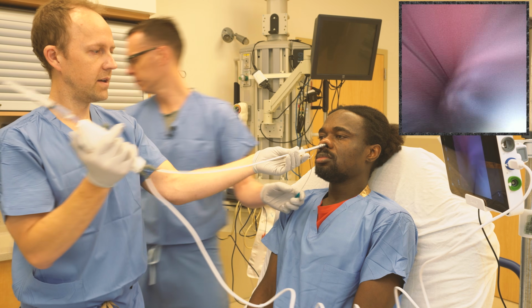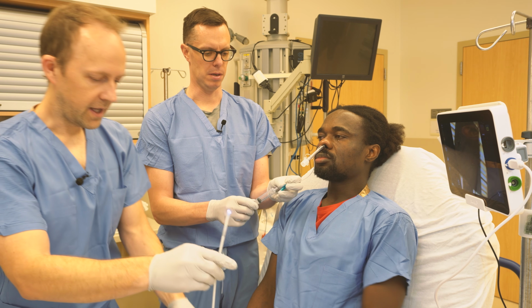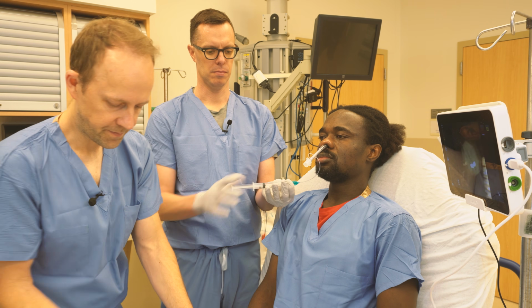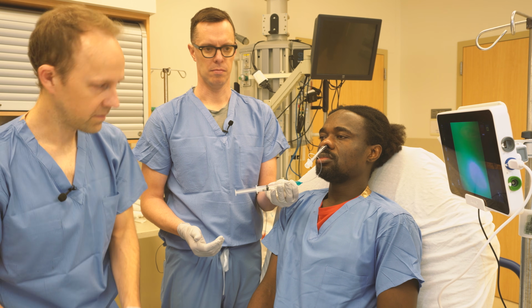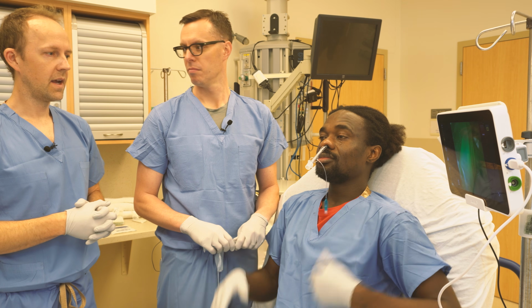Okay, at this point you can remove your scope. You can inflate the cuff. And your patient is intubated.